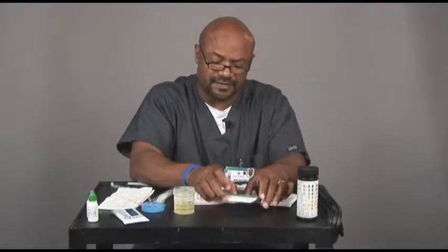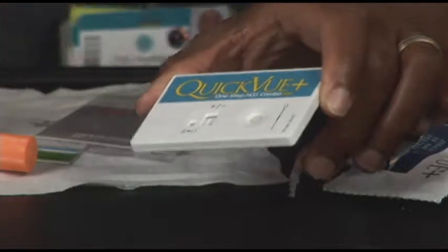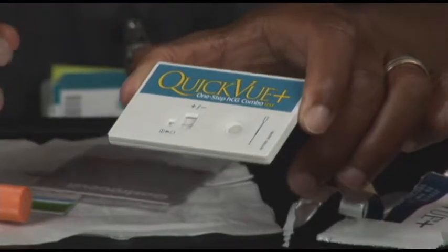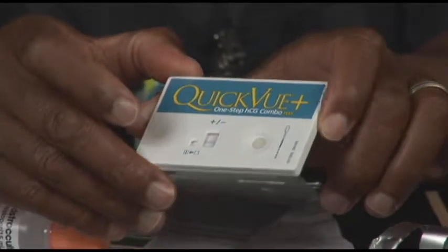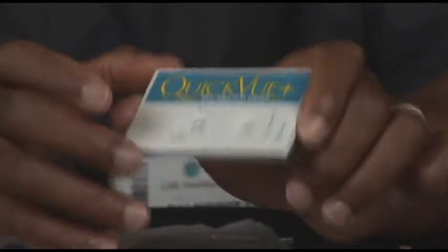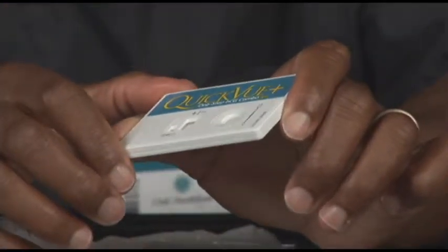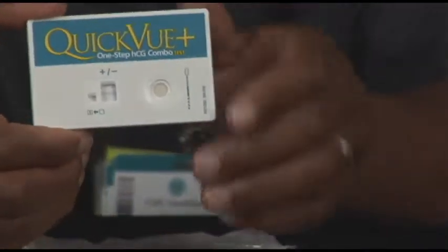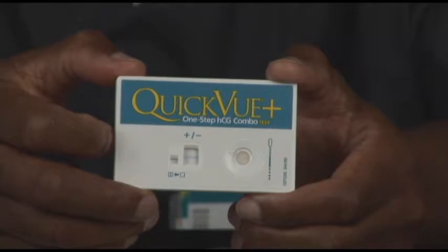It reads in a plus-minus fashion as the urine wicks across. A straight blue line is negative. A pink line down the center, making a plus sign, is positive. Any type of pink line, it can be faint pink or dark pink, any hint of pink is positive. Also, you should have a blue line in your control window. If you don't get that, that means your card is bad and you'll have to use another card.